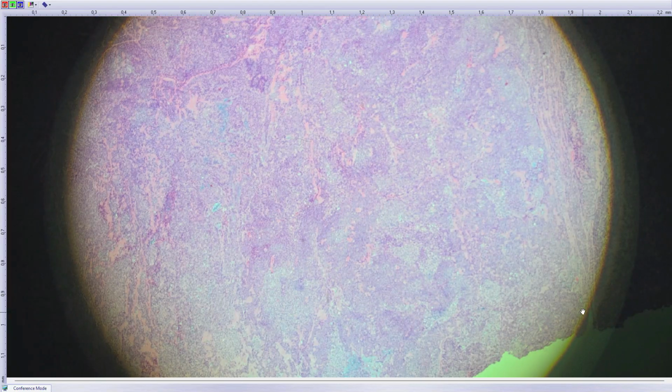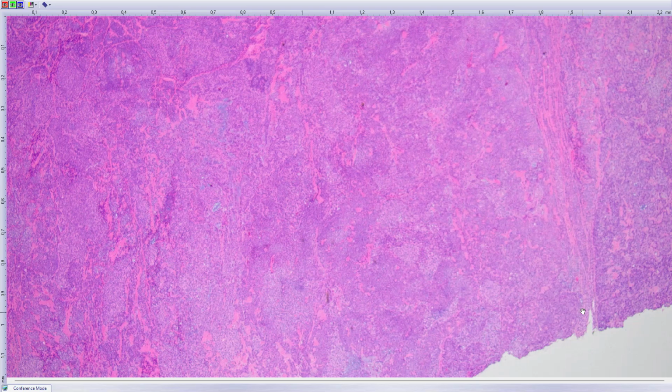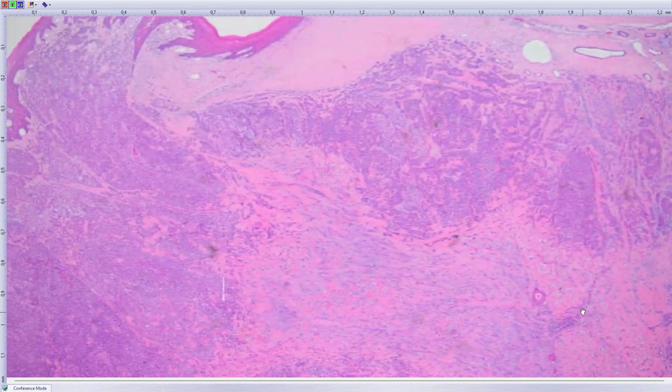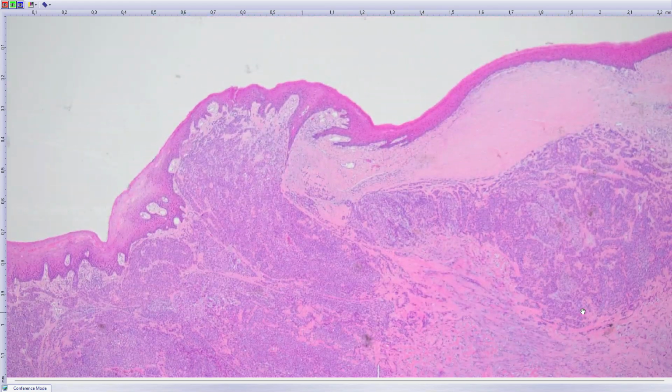The pitfall with pleomorphic adenomas and myoepitheliomas in the oral cavity arising from minor salivary glands is that they are not encapsulated and may really mimic an invasive growth pattern, as this case actually did. So that's the first case I wanted to share with you. Final diagnosis: benign myoepithelioma or cellular pleomorphic adenoma of minor salivary gland.